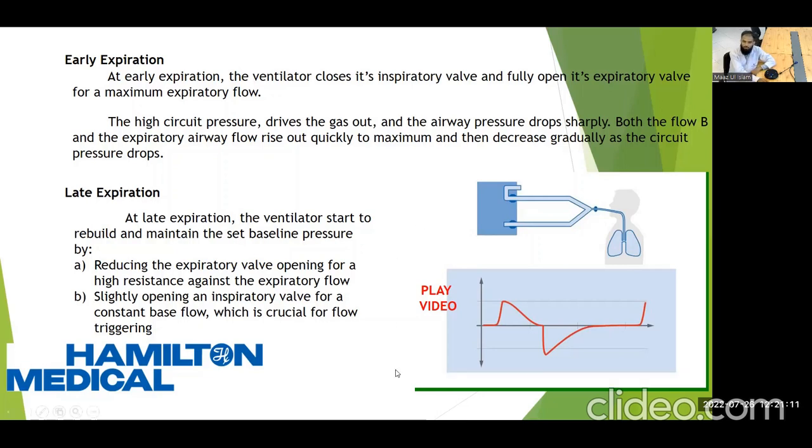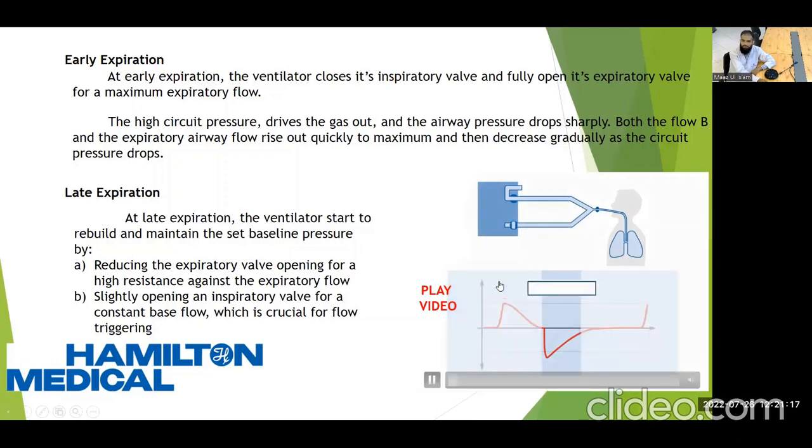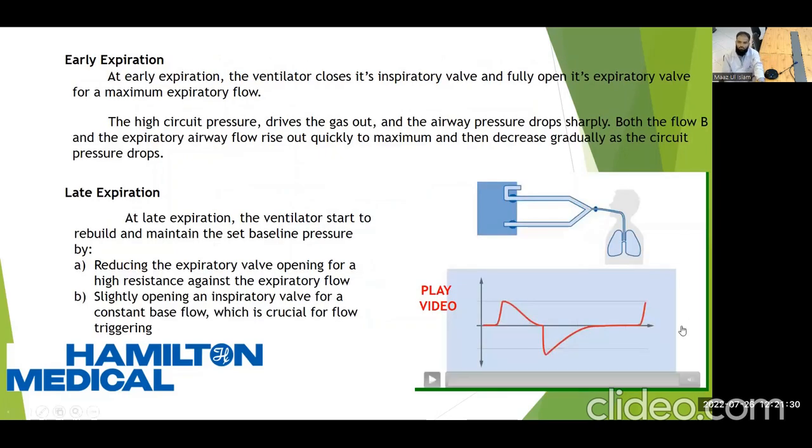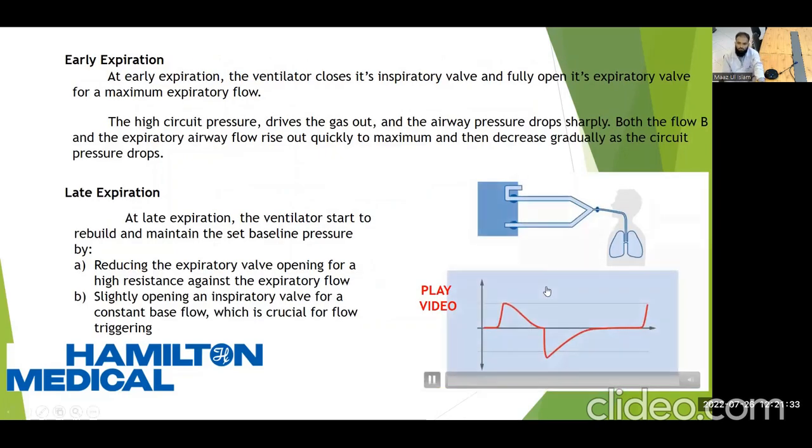So here I have put a video. Let's consider this is an early expiratory time. The inspiratory valve is fully closed, the airway pressure goes out and the expiratory valve fully opens.